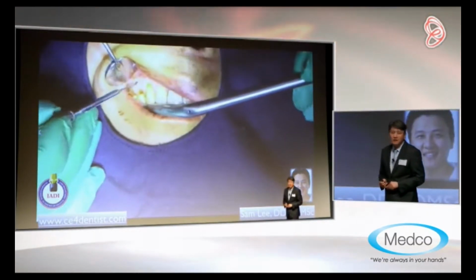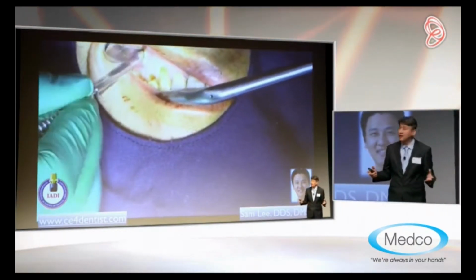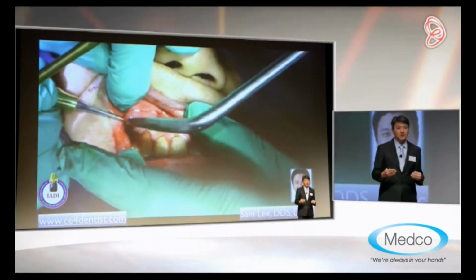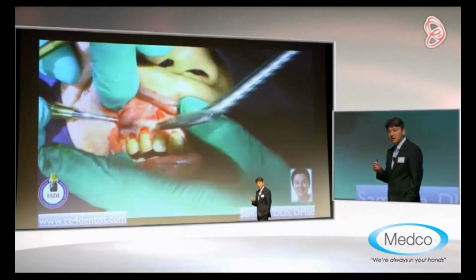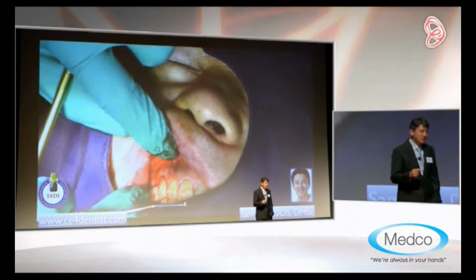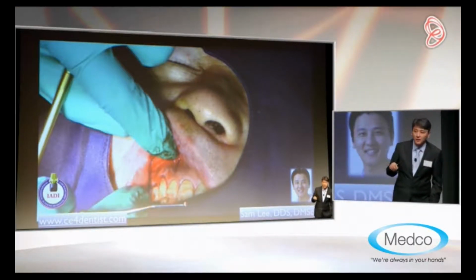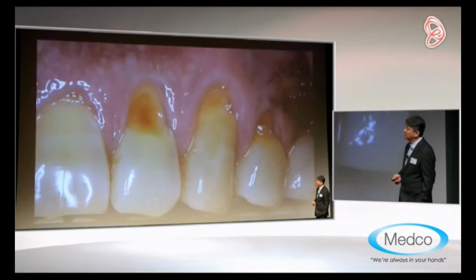So as you can see, nowadays, when we do gum graft or bone graft, I don't open a flap. We just make a very small incision, and we utilize our Cobra instrument to move the gum down coronally. And best of all, we do not suture the patient, because we found out that suturing causes a lot of micro trauma. So no suturing is necessary. We just position the gum down. If you want to build bone, you can add bone by utilizing decortication with a back action chisel, and then you put a membrane and so on. But for recession, it is not necessary.